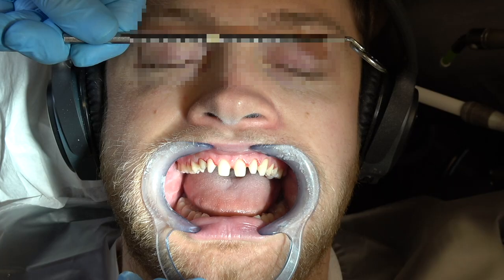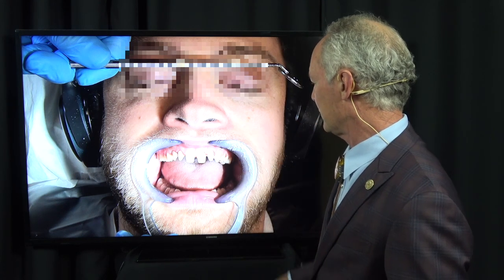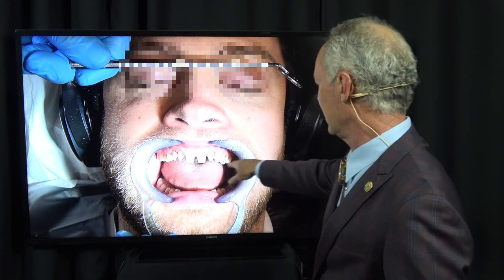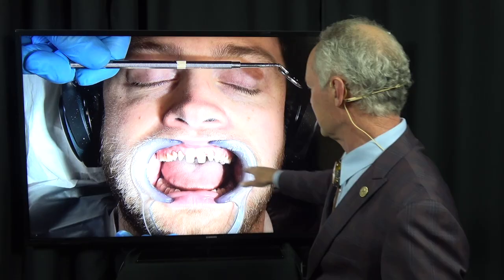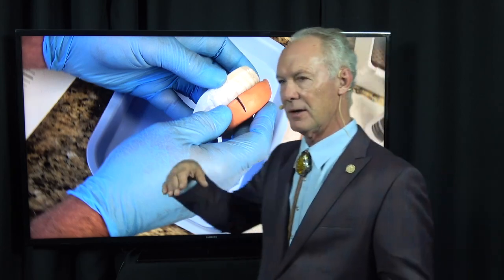So you can see everything draws. Now this is sent to the laboratory and this confirms the face bow mounting for the technician. The technician can see that the incisal edges of the central incisors are parallel to the pupillary line. So he can confirm that the models of the prepared teeth mounted on the articulator are correct, that somebody hadn't bumped the face bow and it's off. He can see what the preparations look like in relation to the pupillary line. The pupillary line represents the horizon or the floor or the lab bench.